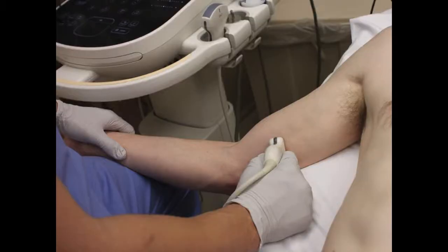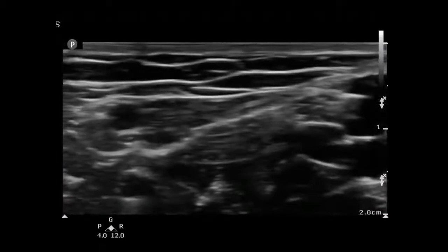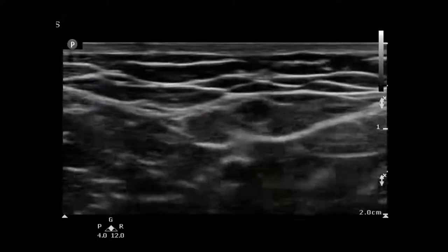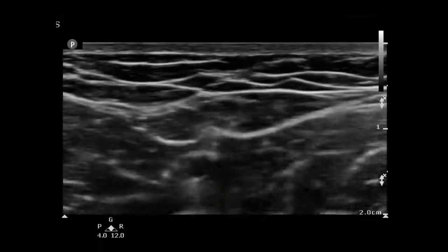The basilic vein is actually the vein that I like using the most. The reason for this is there's no dangerous surrounding structures — no artery, no nerve around it. Here you see the brachial veins, arteries, and nerve, and as I rotate medially, you can see that there's a vein right there, easily compressible, and there's really no other important structures around it.